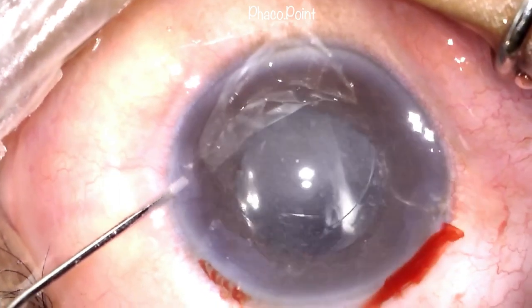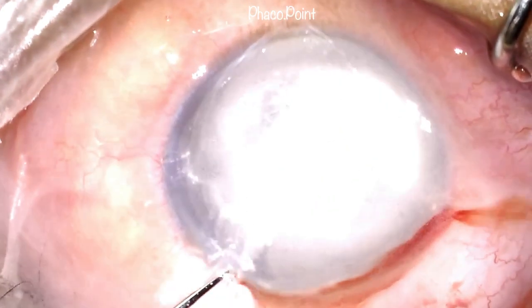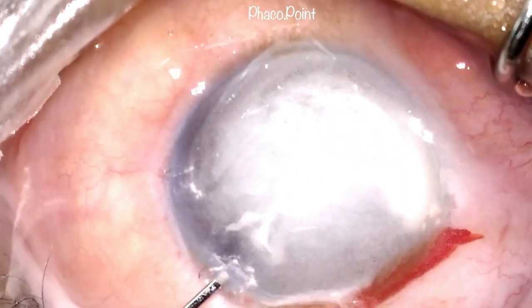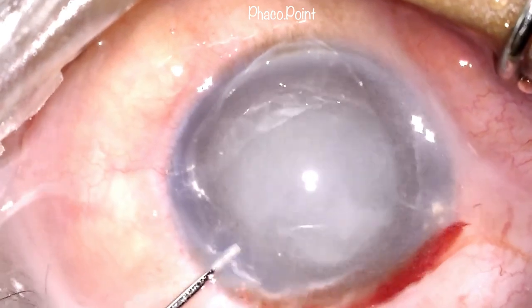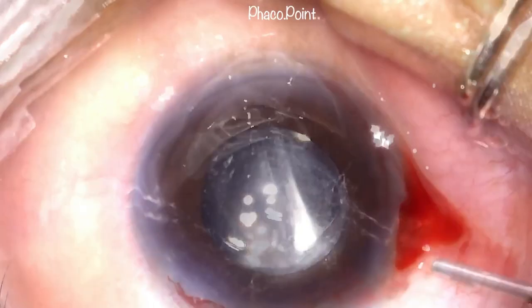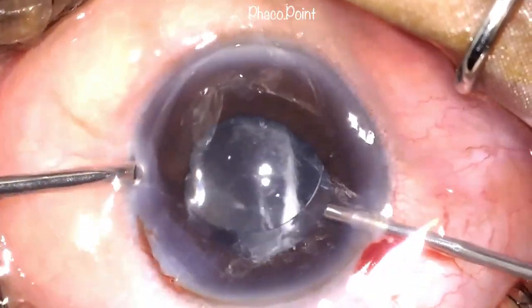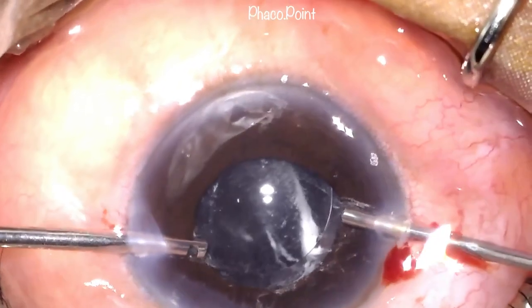Some more triamcinolone is injected into the eye to ascertain the presence or the absence of any more disturbed vitreous. The residual vitreous is further cleared by performing some more anterior vitrectomy.